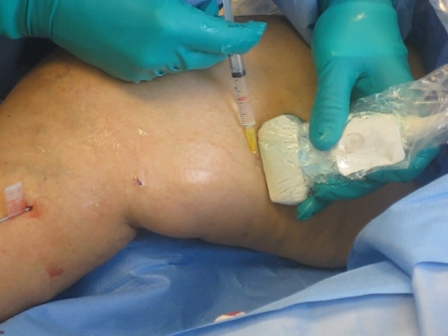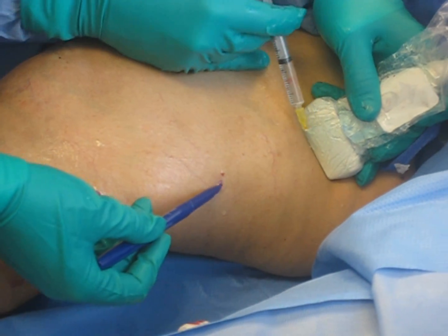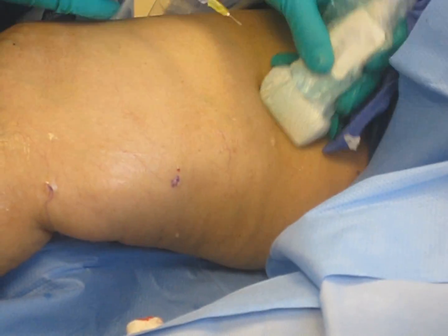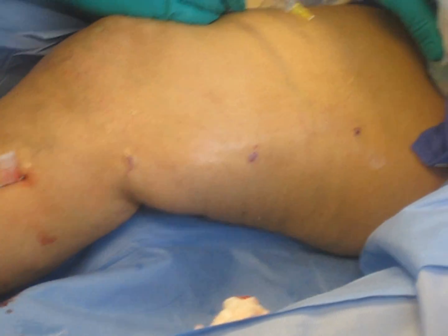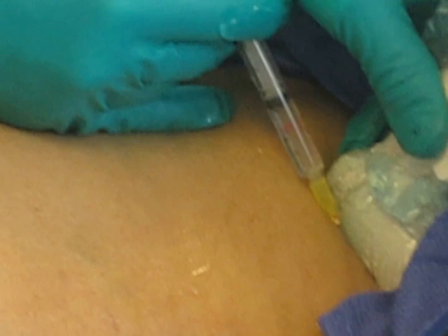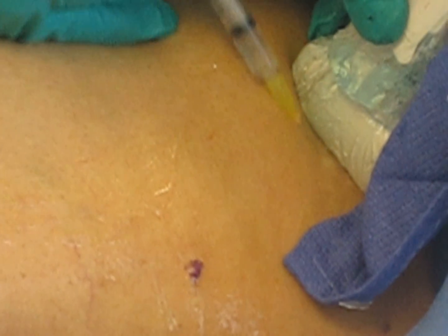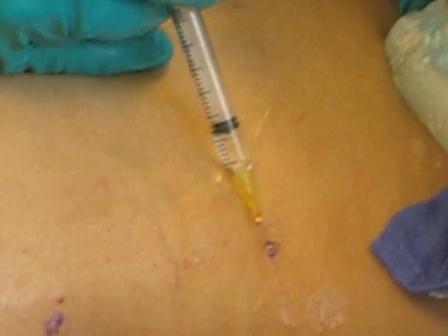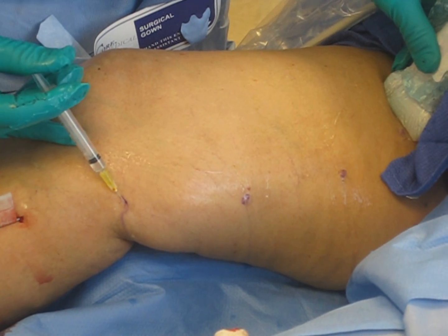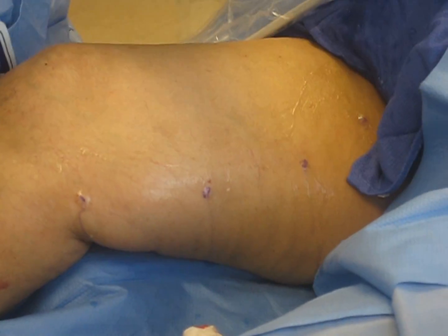Another little pinch here, and right there — I'm trying to give a little warning. One last one. One last little number here. Just marking that, putting a little extra here — I'm going to make this as comfortable as possible. Our next step will be to just pump fluid all the way around this vein.